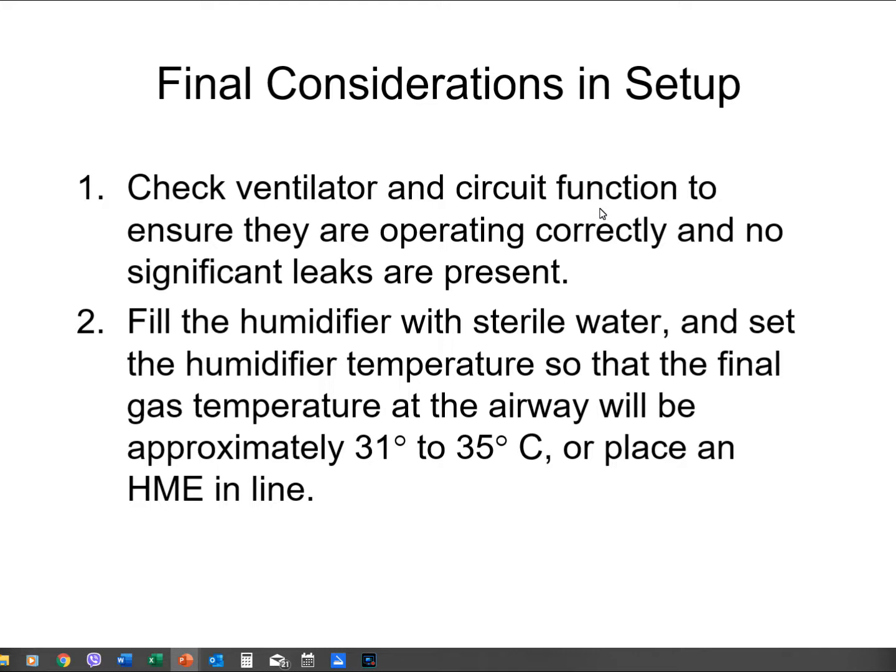Make sure on the Y you have a cover for the temperature port, and sometimes it falls off. Okay, and that's going to cause a leak. So you want to make sure that port cover is there, and there's another port cover at the end of the inspiratory limb that connects to your bacteria filter. Some of the circuits have elbows, and that also has a port where you can put a temperature probe. You want to make sure those are closed as well. And sometimes manufacturers won't close them tight, so you want to make sure that those are fully closed.